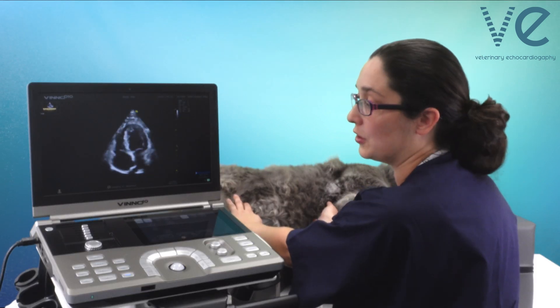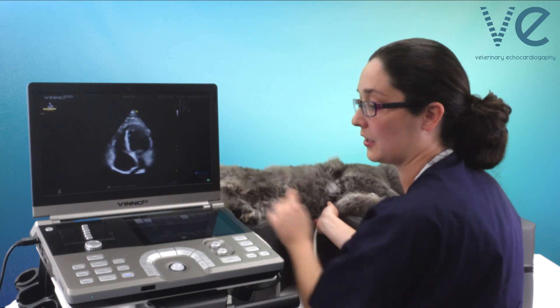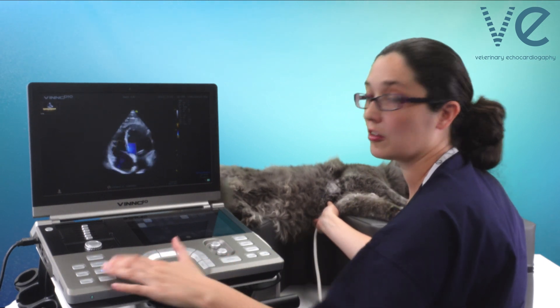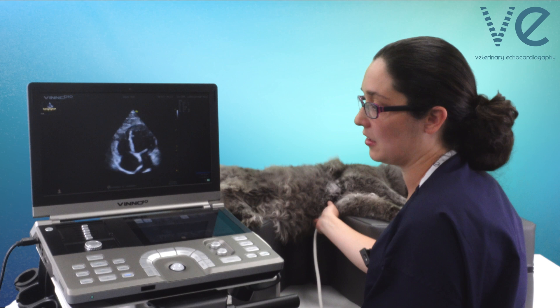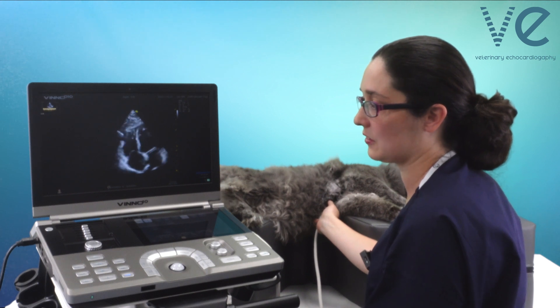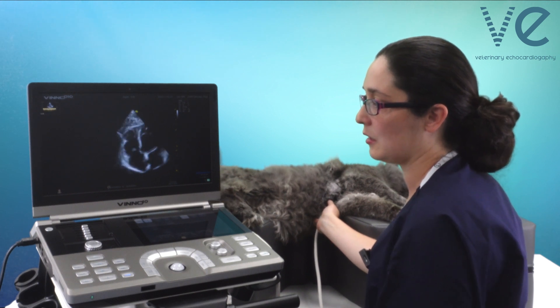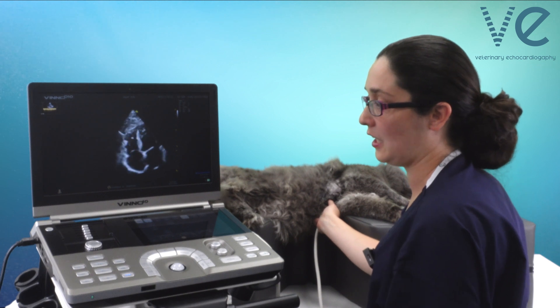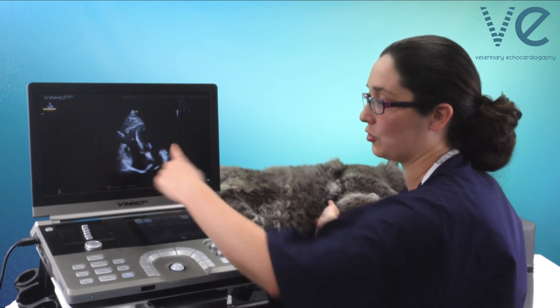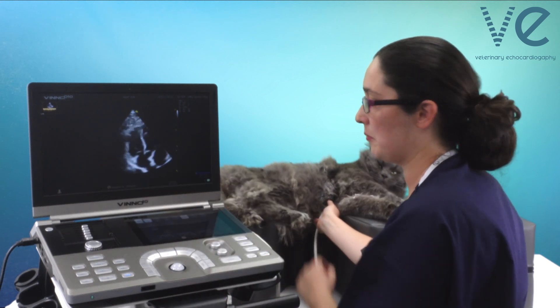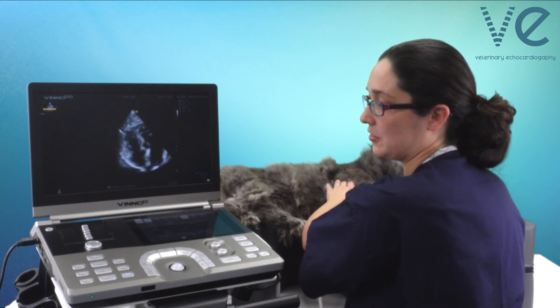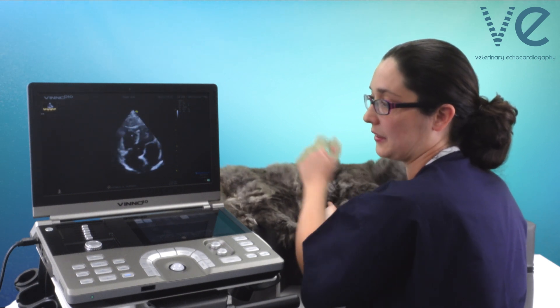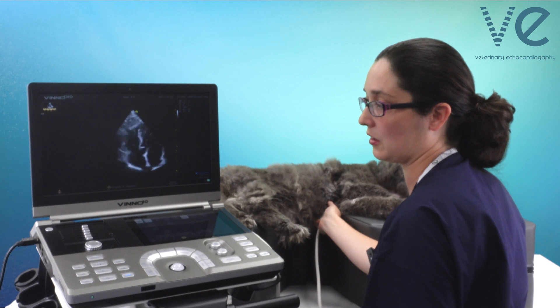From my apical four chamber view, I could put colour over the tricuspid valve and I get a little flash, but it's not great. So I really want to make the right ventricle the focus of my view. I'm going to slide it across, keeping the apex of the left ventricle still at the apex — just making the right ventricle more of a focus. I'm making sure I don't open up the left ventricular outflow tract, because if I do, I'm going to catch that in my trace. So I want to make sure that's closed.